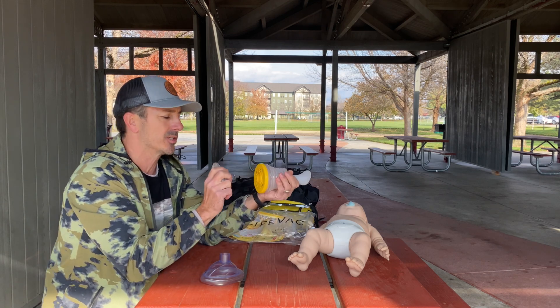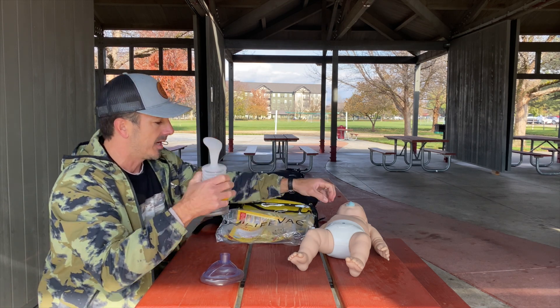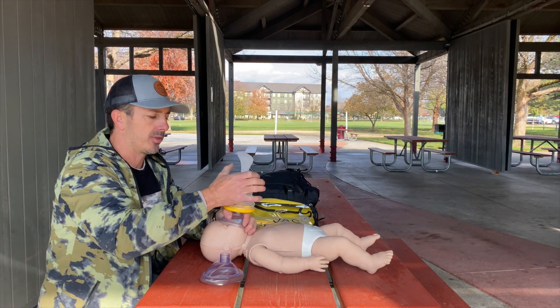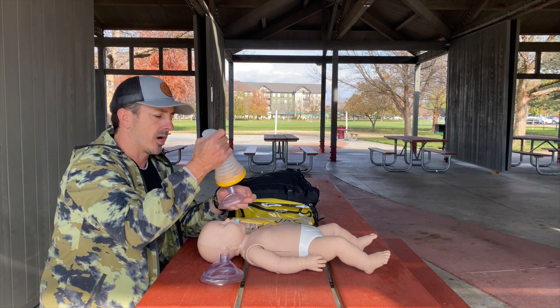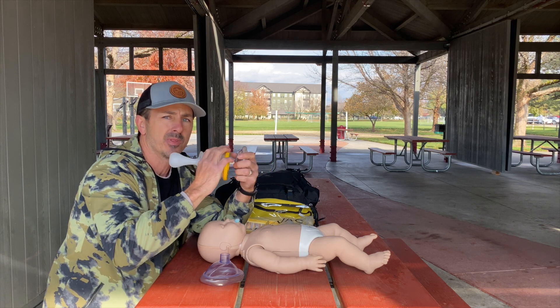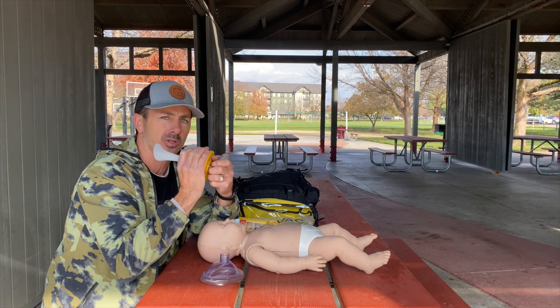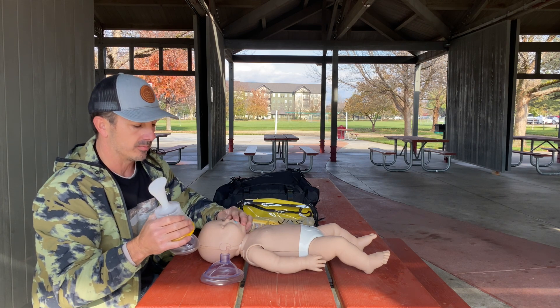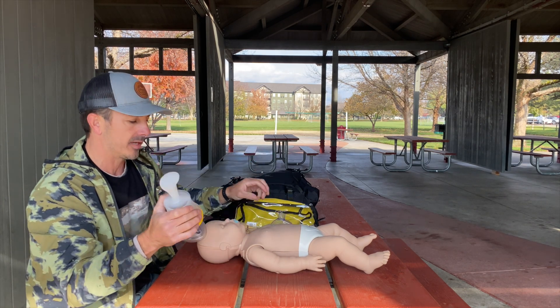The number one mistake people make when they put these together is they just push it in and go to use it. Then when we go to remove the object out of the baby's mouth and press, the top comes off. So I always teach — and so does Life Vac — that you want to place this in, push, and twist so it locks in.